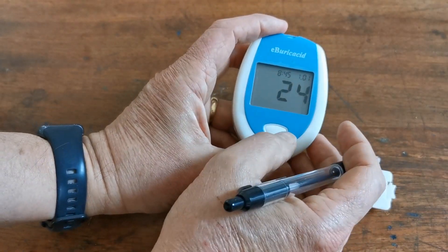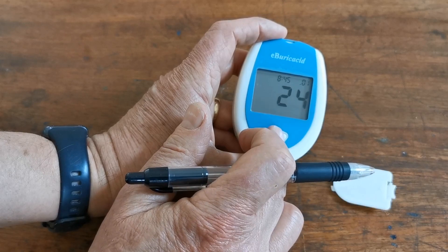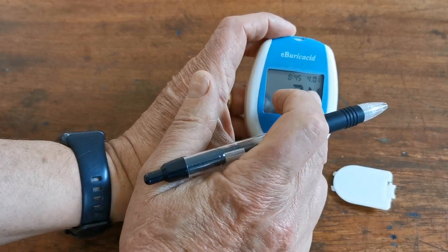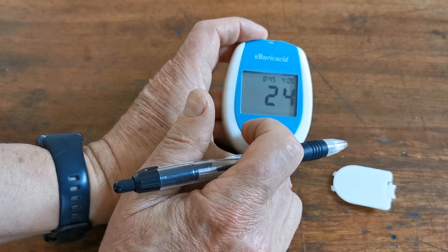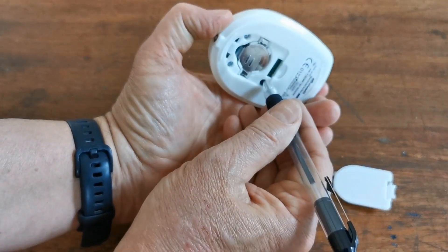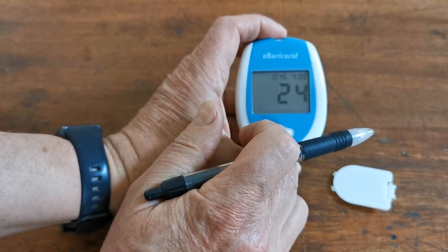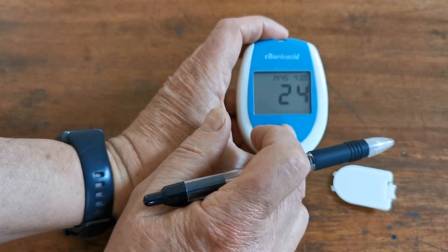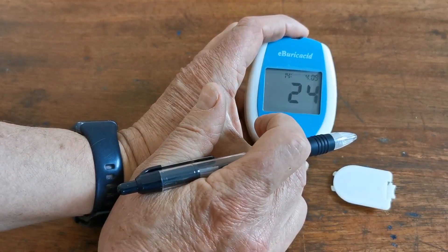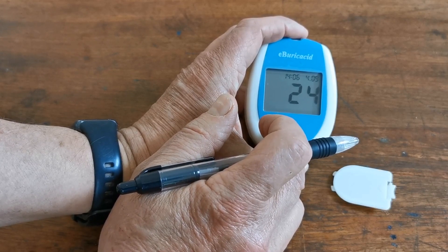Press it again and it is now asking for the month. Go to April and press it again — you can see the day flashing. Go to the ninth and then press it again for hour and minute. It's a 24-hour clock, so go to 1400 hours and run it around to 15.